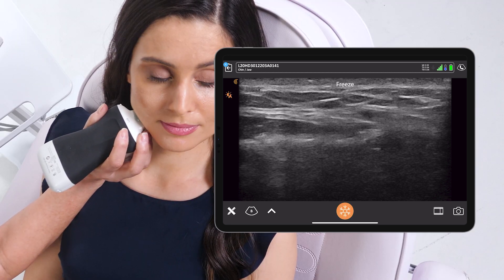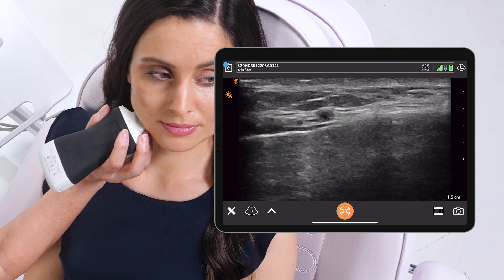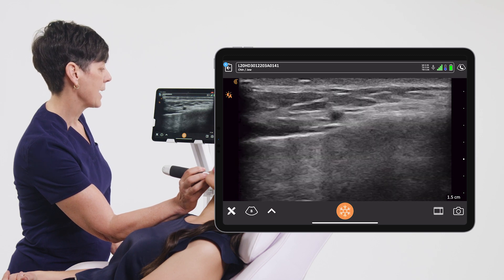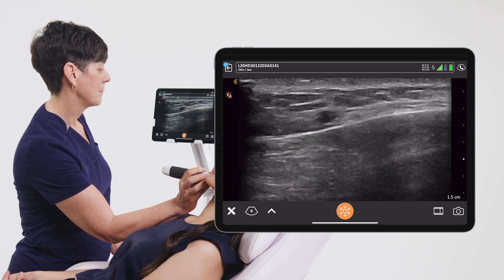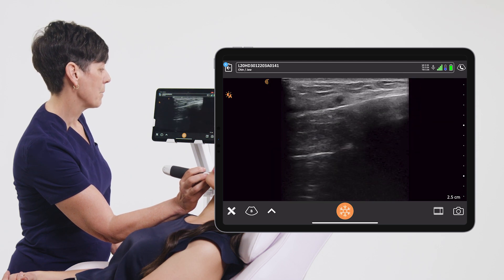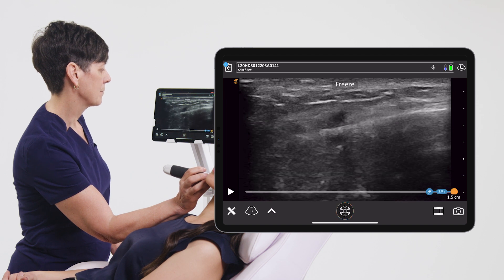Freeze. Increase gain. Decrease gain. Increase depth. Decrease depth. Freeze. Capture image. Freeze.